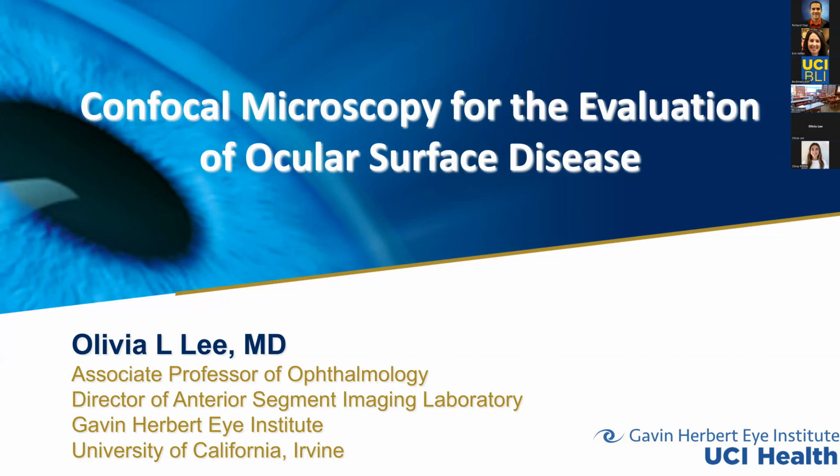Okay, great. So in this talk, I wanted to give you an overview of my work on using confocal microscopy specifically for ocular surface diseases. In ophthalmology, we know very well that confocal microscopy is typically described as used for the diagnosis of a parasitic corneal infection called acanthamoeba keratitis, which is relatively rare.